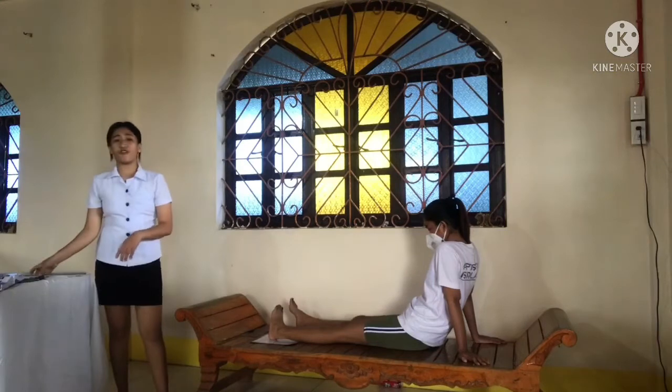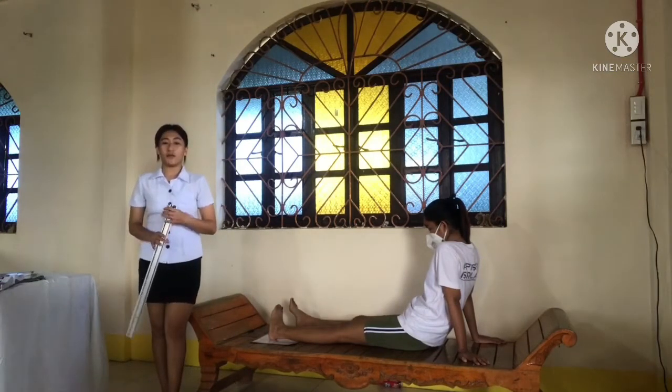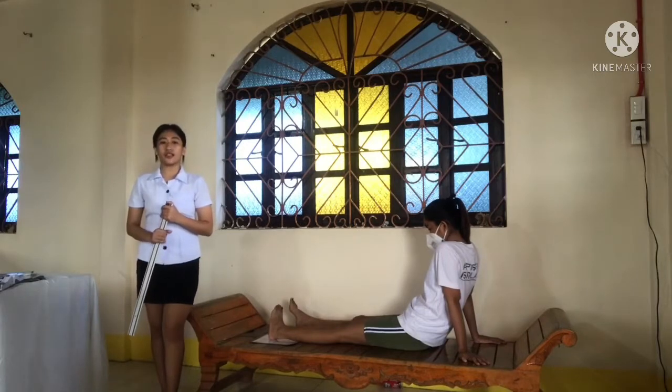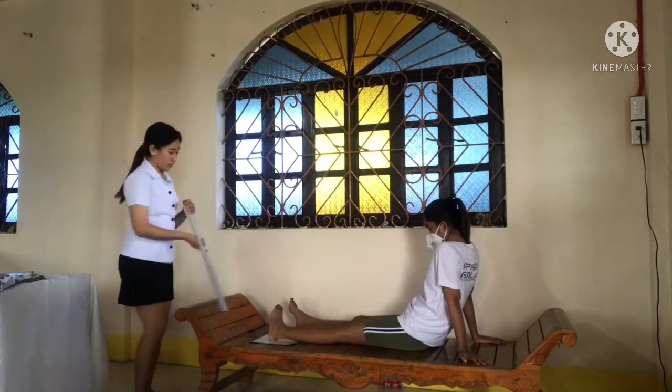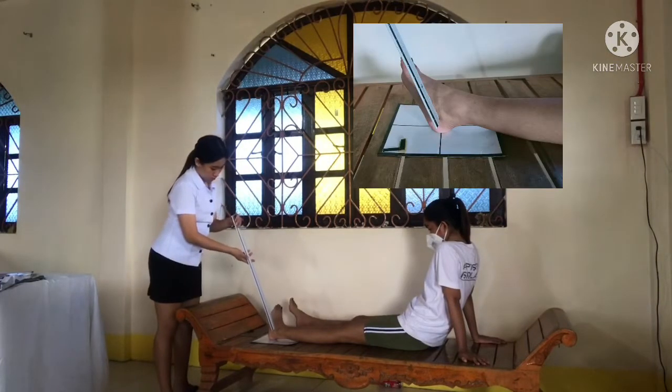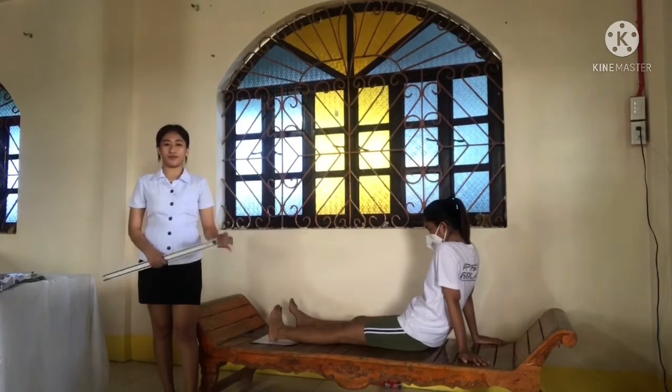So the central ray for this projection is directed to a point 1 inch distal, 1 inch anterior to the lateral malleolus at an angle of 10 degrees cephalad. So this shows the middle articulation of the subtalar joint and an end-on projection of the sinus tarsi.